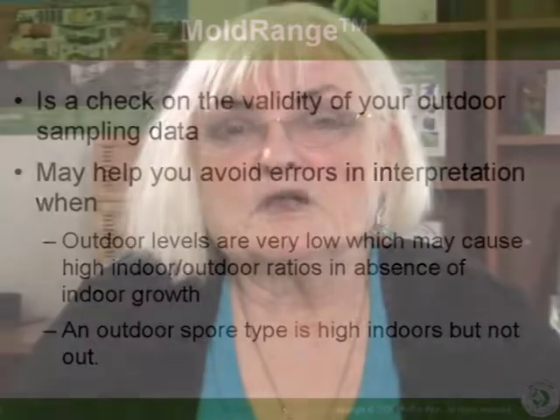For example, if there's very, very low concentrations of, let's say, Cladosporium outdoors and relatively high concentrations indoors, you can look at the MoldRANGE and you'll see perhaps that the level that you got in your sample is at the very bottom of the range that Cladosporium would be in at that time of year. And so it's very possible that what you're seeing indoors came from yesterday's population of Cladosporium, which may have been closer to the average for your particular area.